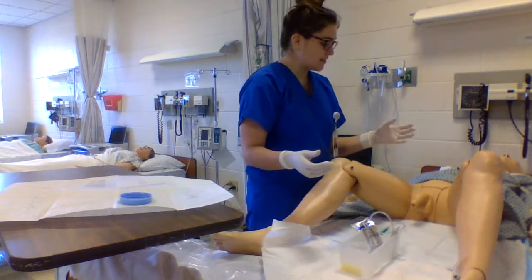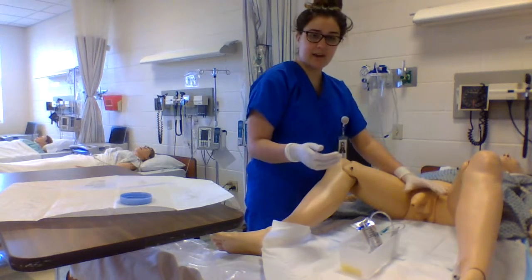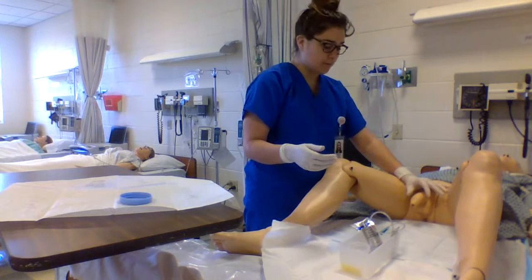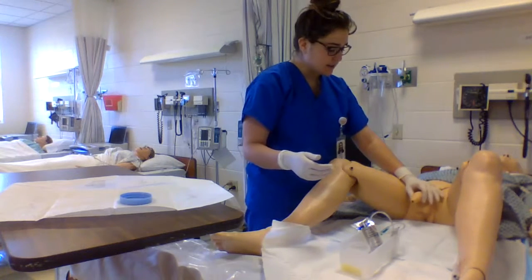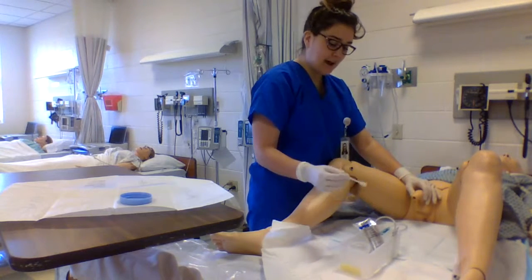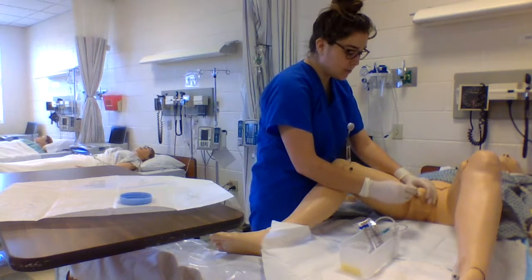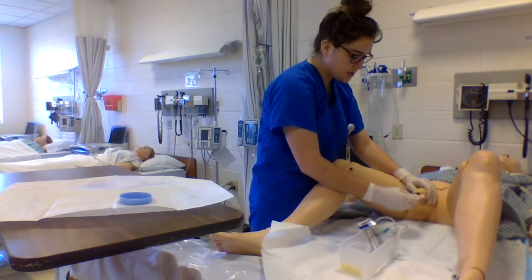Mr. Smith, I'm going to touch you, okay? So I kind of touch right there. If he is uncircumcised, I will pull the foreskin back so I can clean the meatus. I'm going to clean it with one swab at a time. I'm going to take the swab and start at the meatus and work my way downward in circular motions.